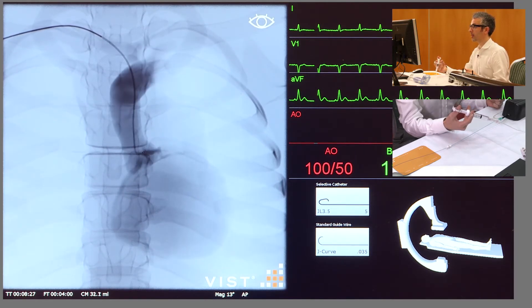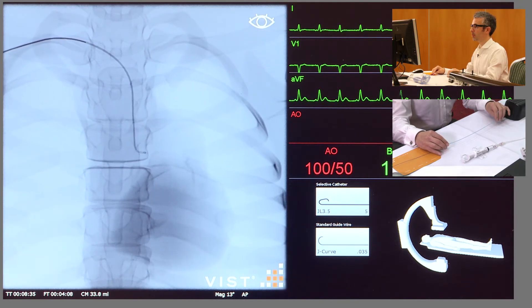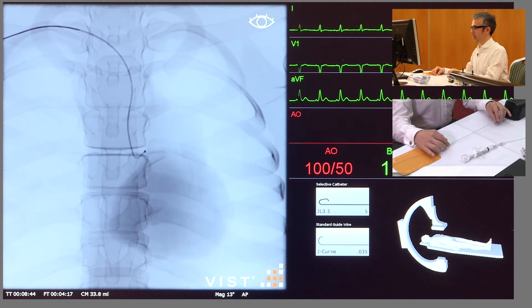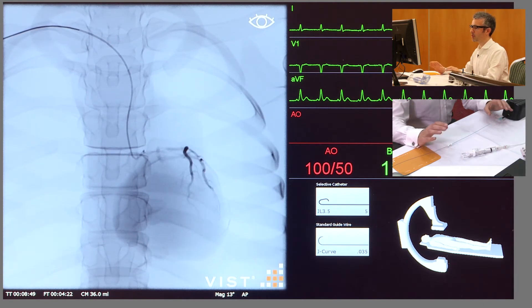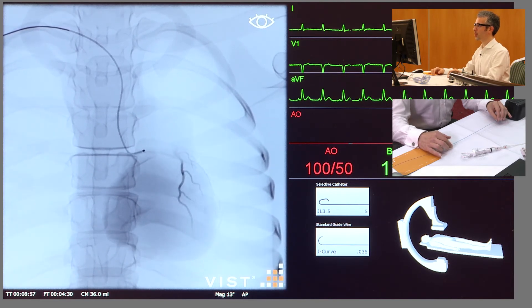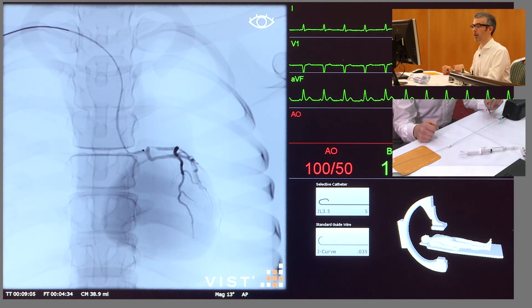So we're taking a gentle puff here and we can see that we're very close to the ostium but not quite selectively in it. What we're looking for is to see the catheter move into the artery, and you often will see it jump across like that. Again we check our pressure tracing — gentle injection. At the moment this catheter is not correctly orientated; it's pointing up a little bit into the roof of the aorta, so I'm going to gradually pull it back and torque it so it's lying much more in a horizontal plane. Checking our pressure tracings — okay — and gentle injection, and we can see the outlines of the coronary vessels.